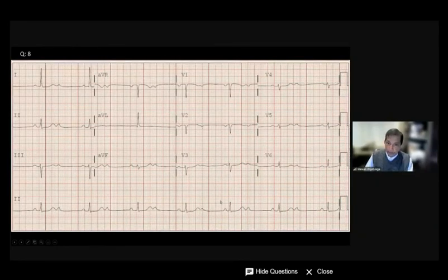You saw the previous one, and you see now. What do you see here? This woman flips back and forth between this kind of rhythm. Is it sinus rhythm? There is something off here, something like an AV block. I don't know where the AV block is, I need to test more. Or is it Mobitz type 1? Or Mobitz type 2? Or is it a non-conducted PAC? We talk about non-conducted PAC. So all these things cross your mind. What do you think this could be?